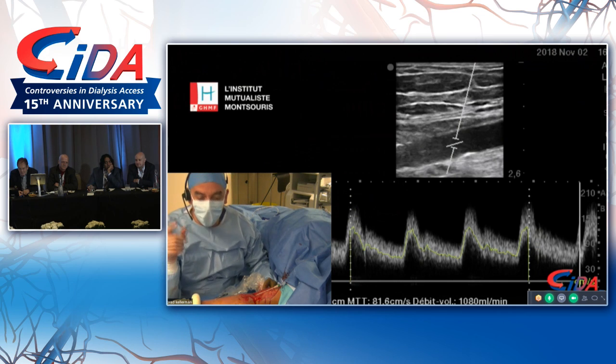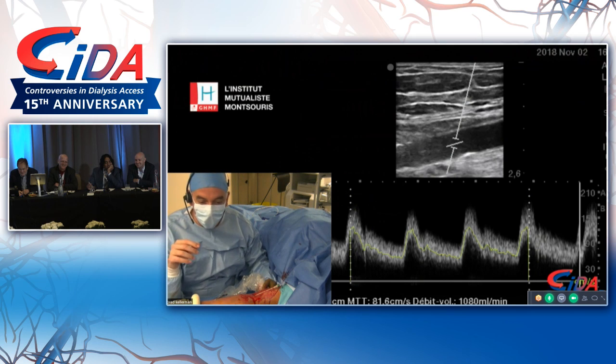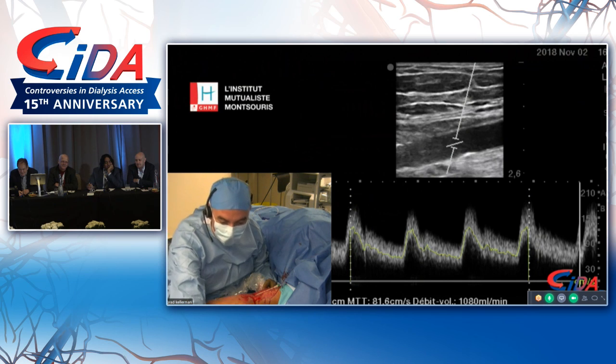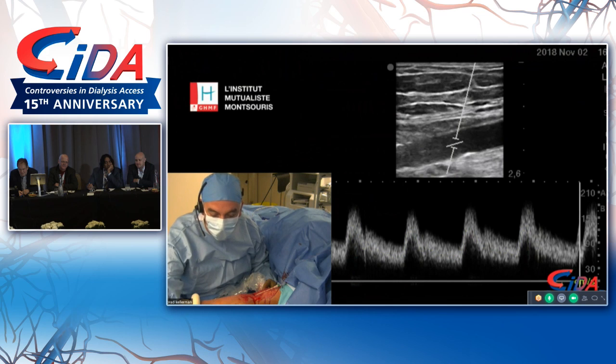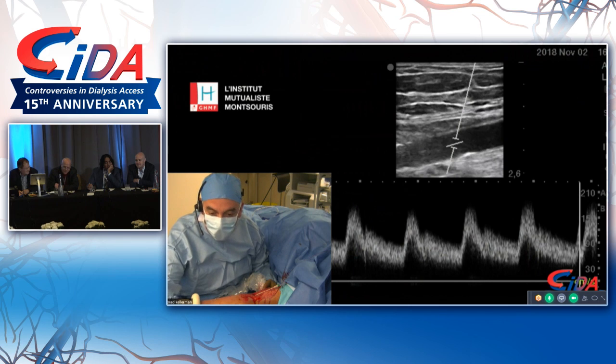Wow. So, are you going to reduce the flow a little bit? I don't know. Perhaps I'm going to measure the. Open the gate. I overestimated a bit. I opened the gate a bit. Yeah, I think I'm cheating a bit.